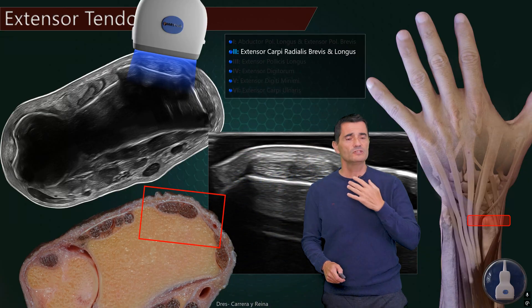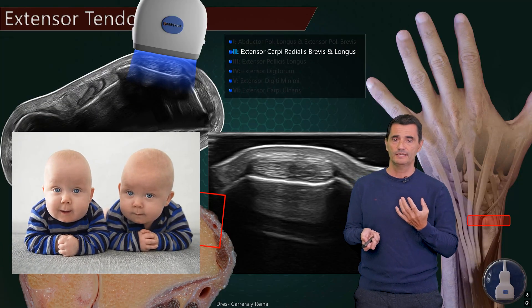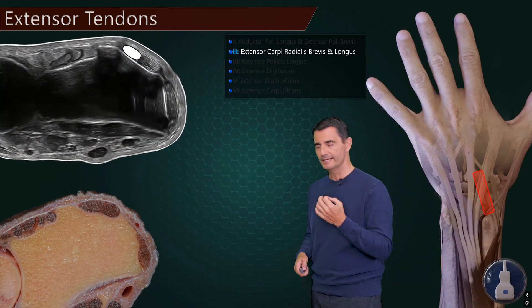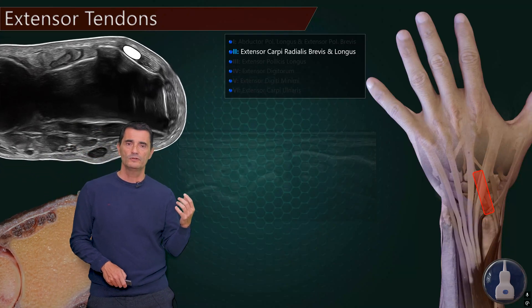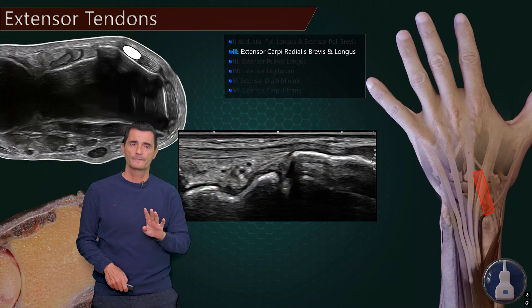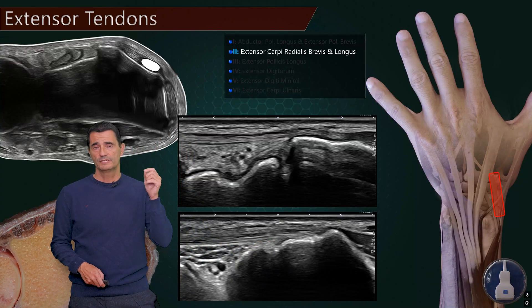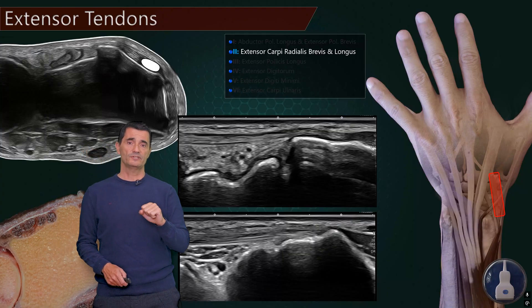These tendons are very similar in terms of shape and size — for me they are like twins. This 'bold twins' image is the best to remember the extensor carpi radialis brevis and longus. If we turn the probe over the extensor carpi radialis brevis, we see the tendon on its long axis and its insertion at the base of the third metacarpal. The extensor carpi radialis longus inserts at the base of the second metacarpal. So brevis at the third, longus at the second — and both are extensors of the wrist.